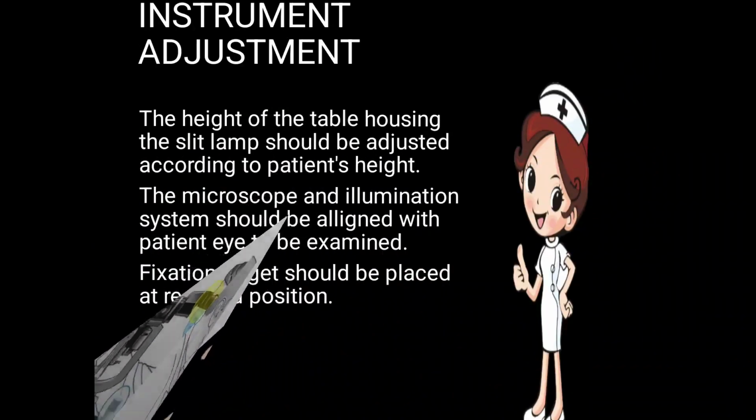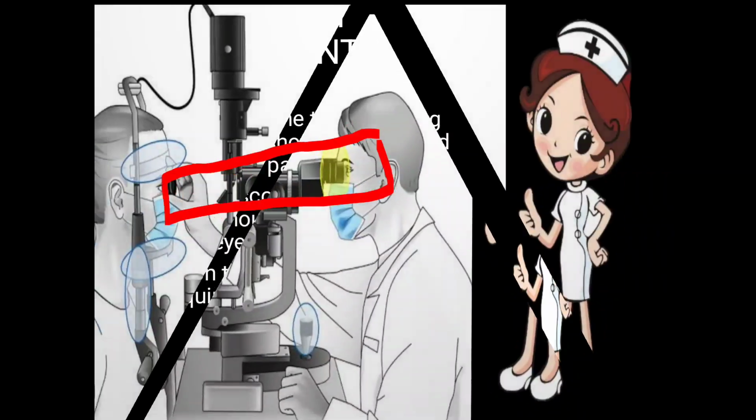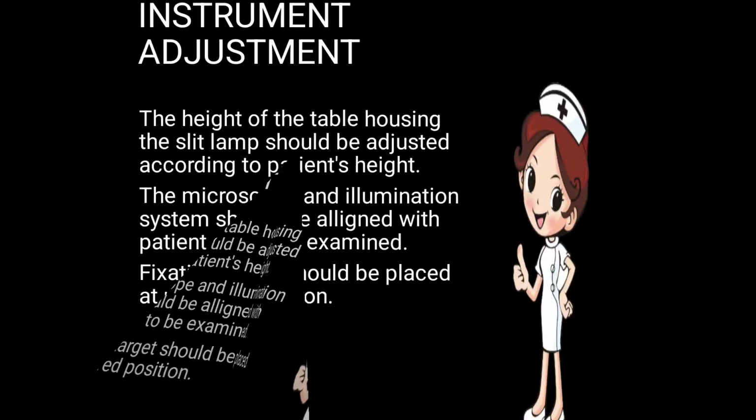Next one is the microscope and illumination system should be aligned with the patient eye to be examined. Okay, if he is examining the right eye, then this may be in the position with the right eye, and the fixation target may be given to the patient if we are examining the patient. Any target is given to the patient for comfortable checking.